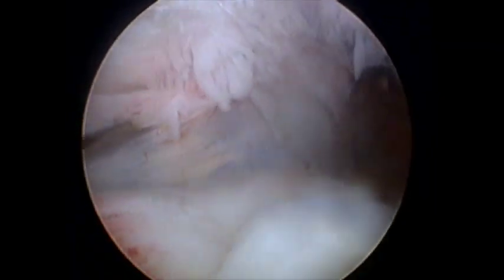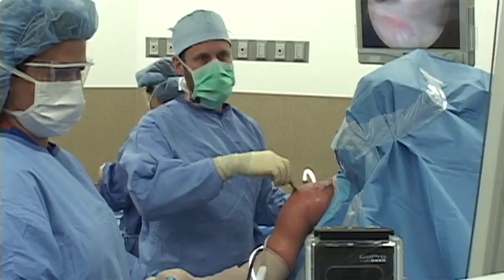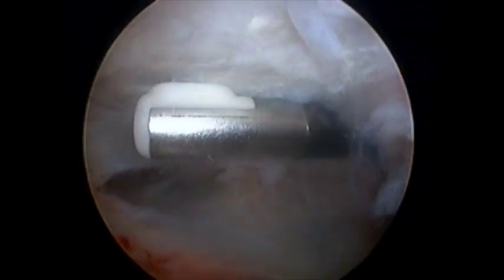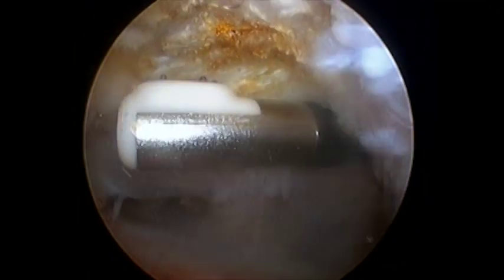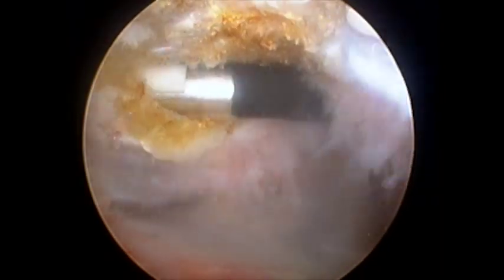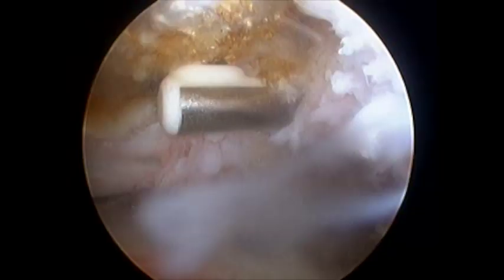At this point we're done with the rotator cuff repair. There's no more hole in the tendon — it's all tied down and pushed down against the bone. But still, we need to make sure there aren't any bone spurs that might push or rub against the tendon. To do that, we're going to clear this soft tissue off of the bone up here. This is called the acromion, and this is where many patients — especially in their 50s and 60s — will develop bone spurs. I'm just clearing some of the soft tissue away from that bone so we can see it and remove any spurs that may have formed and might potentially rub against our repair, irritate it, or even in a worst case scenario, re-tear it.